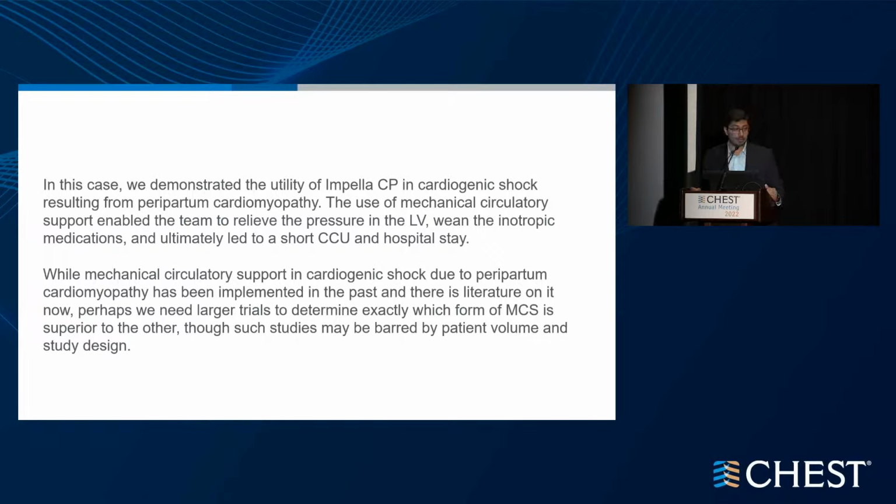While there has been implementation of mechanical circulatory support for this syndrome, and there's literature on it now, perhaps we need larger trials focusing specifically on Impella. But considering the morbidity and mortality of this condition, those trials may be marred by how risky this condition is and by patient safety.